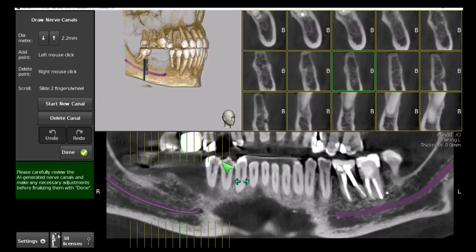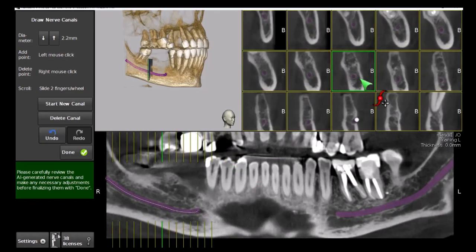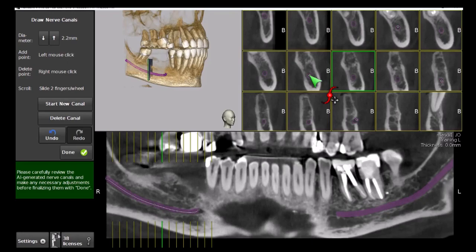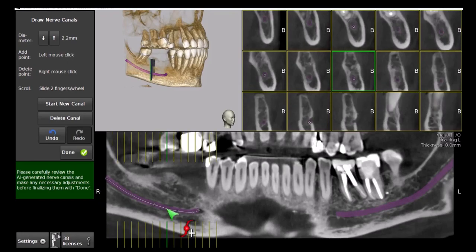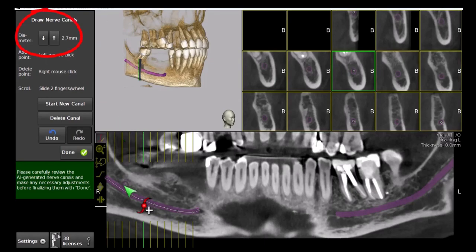Where adjustments to the marking are needed, the purple circle marking the nerve can be dragged on each cross-sectional view so it fully coincides with the canal. Editing points can be added to the canal's marking by left-clicking on the white line, then dragged for better adjustment. The diameter of the marking can also be adjusted if needed.